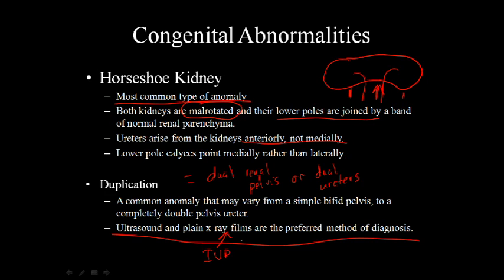And so if you were doing a CT, you would have to have it with IV contrast. So keep that in mind. A CT without IV contrast is not going to be much help at all. So you definitely need a CT with IV contrast for this.